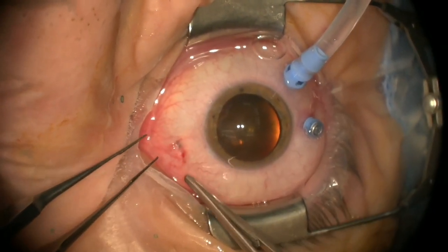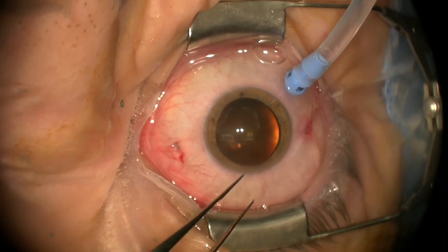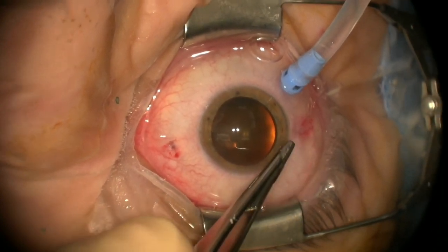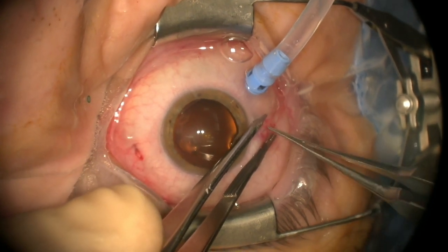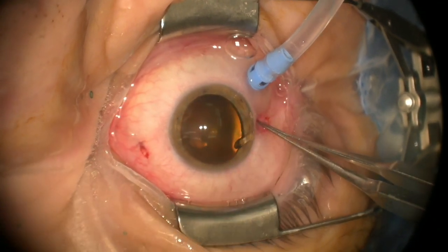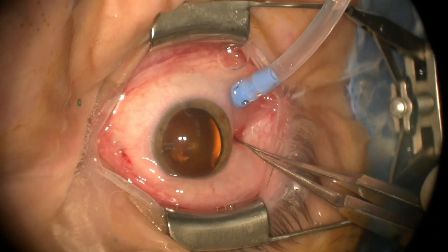Okay. Jenny will check with a Q-tip over there for me, and we'll see that it's not leaking. This one, same thing. Look for where the wound is at. We see it right there. Learned that from Dr. Goduni. She said, spread the forceps, find the hole. This is the Dr. Rao technique, the collapse the tunnel, one of my partners.